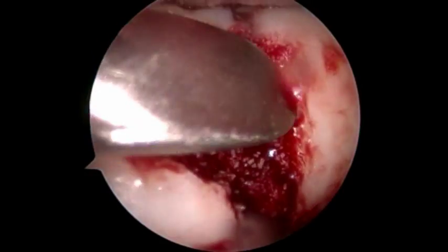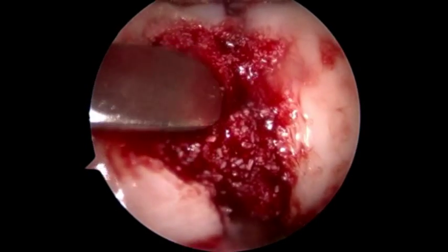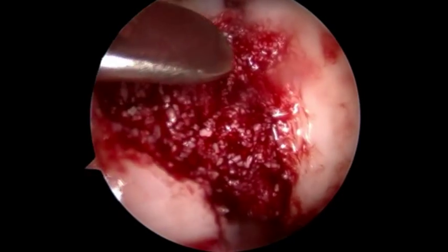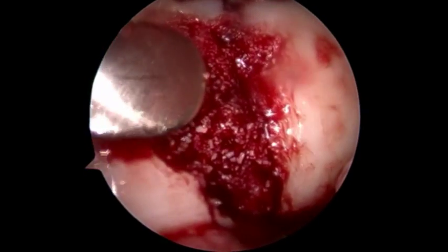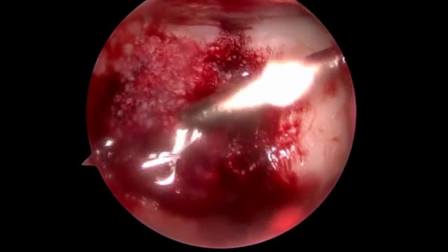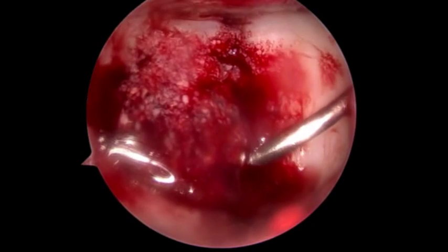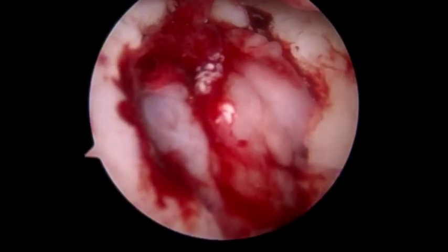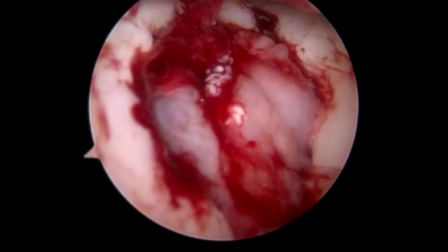Here you can see a metal spatula, which was mentioned earlier, that is used to help smooth out the BioCartilage to a nice, even distribution. After this, the fibrin is placed over the BioCartilage in similar fashion to before. And finally, you can see the finished product of the BioCartilage placement in the trochlea lesion.